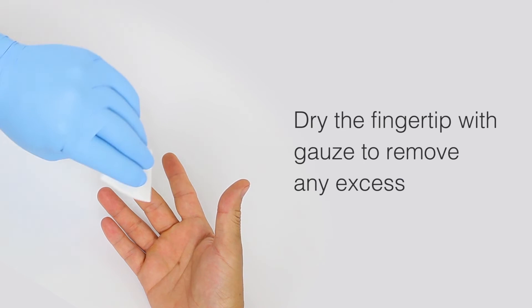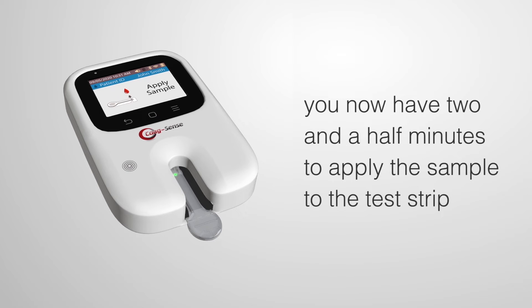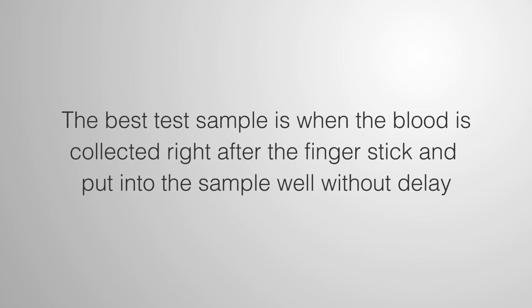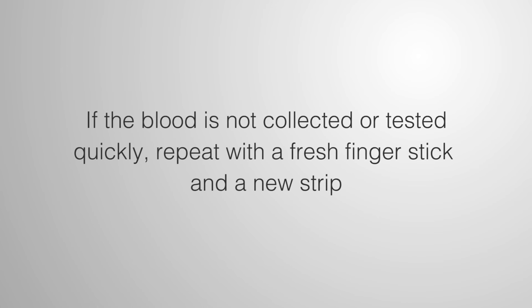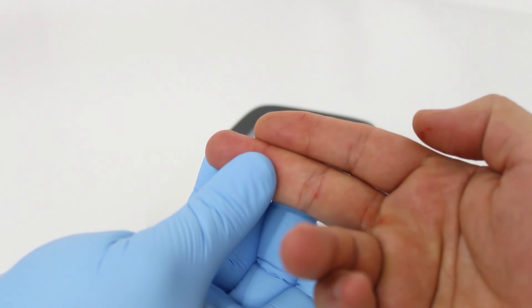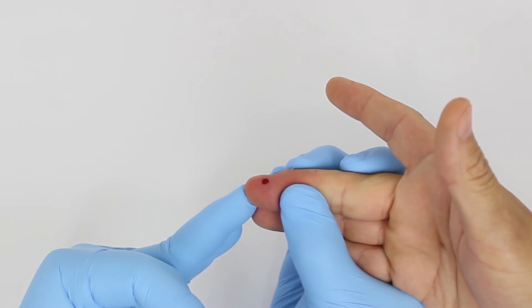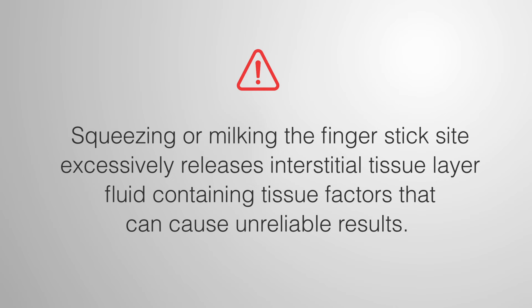Clean the patient fingertip with an alcohol wipe and dry with gauze to remove any excess. After 'Apply Sample' is displayed, you have two and a half minutes to apply the sample to the strip. The best test sample is when blood is collected right after the finger stick and put into the sample well without delay. If the blood is not collected or tested quickly, repeat with a fresh finger stick and a new strip. Use only 21-gauge lancets, as smaller diabetes lancets do not produce sufficient whole blood volume. Just a 10 to 12 microliter drop of blood sample is required. Remember, squeezing or milking the finger stick site excessively releases interstitial tissue layer fluid containing tissue factors that can cause unreliable results.